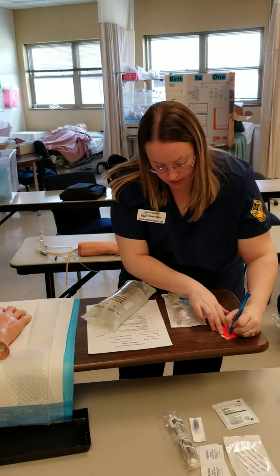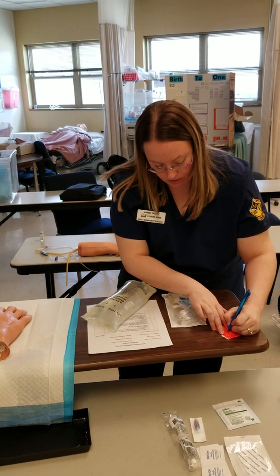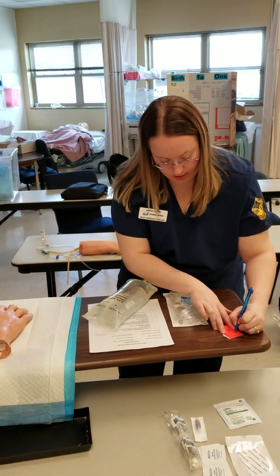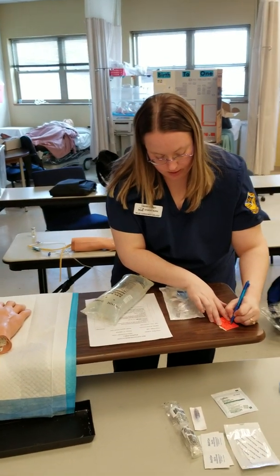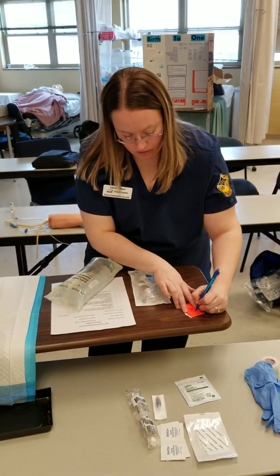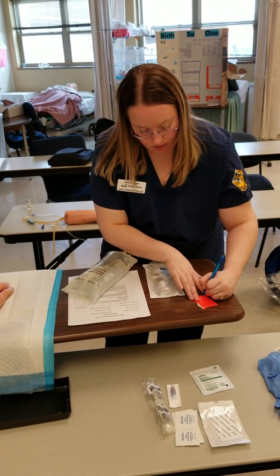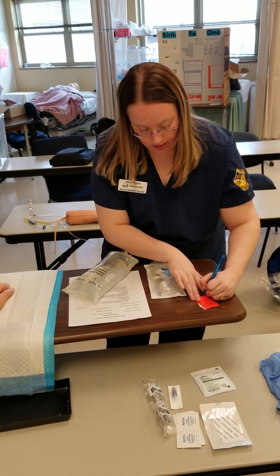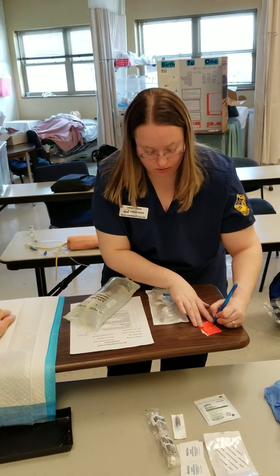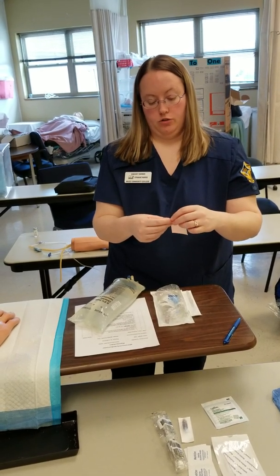the drug, which is the normal saline, the amount, which is 1,000 milliliters, and then my initials, the start time, which we're going to put 6 o'clock, 600 hours, the date, and then the flow rate is 167 milliliters an hour, and then the end time, which would be 1,200 hours. And then that's going to go on my bag of solution.